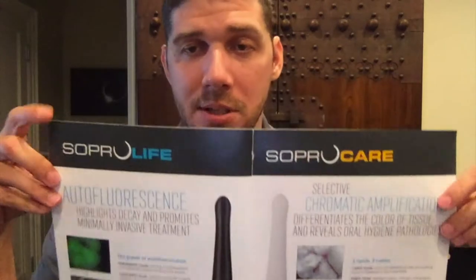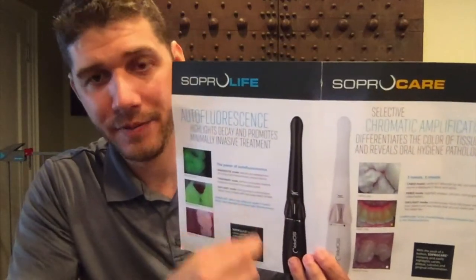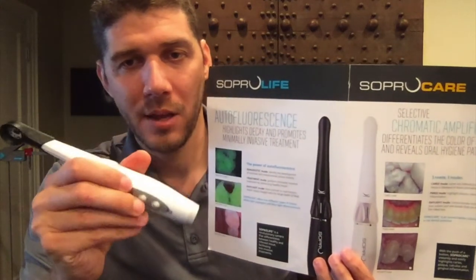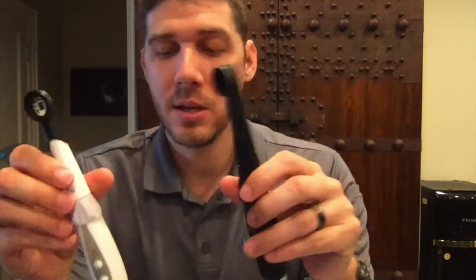We also have two diagnostic cameras: the SOPRO Life and the SOPRO Care. Each of these cameras has two different diagnostic features. You'll notice on the back side of the camera are two different buttons that control the diagnostic features.